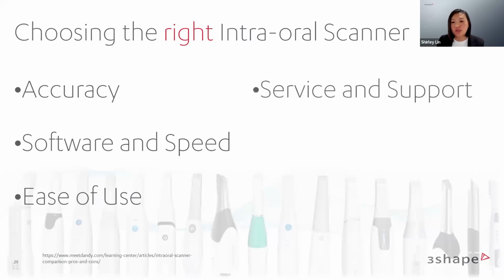Now, service and support. Some of the best scanners on the market will have ongoing subscription plans. Some things to consider are what type of subscription models are available, what is their service level agreement in relation to training, services and repairs, and how does your reseller or your supplier manage those? And is there a warranty that's covered under those?